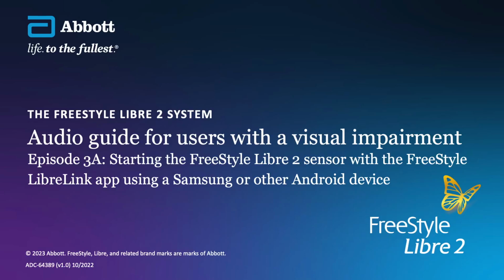Starting the FreeStyle Libre 2 sensor with the FreeStyle LibreLink app using a Samsung or other Android device. First, you will need to download the app onto your smartphone. The app is available on the Google Play Store. You will find it by searching for FreeStyle LibreLink. That's 2 words, FreeStyle space LibreLink.